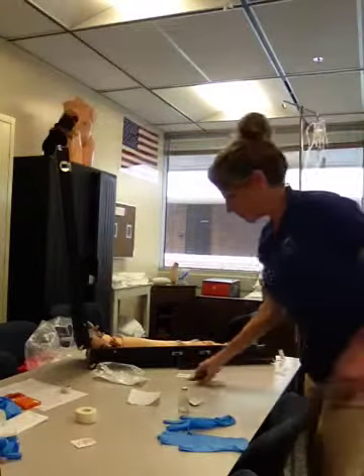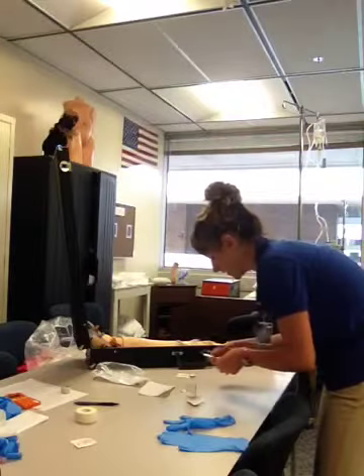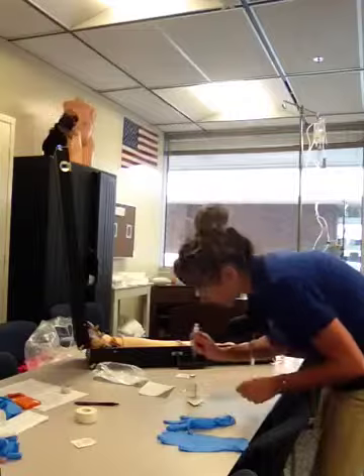All right, now before I go into the patient's room, I'm going to pull up 6 milliliters of regular saline.